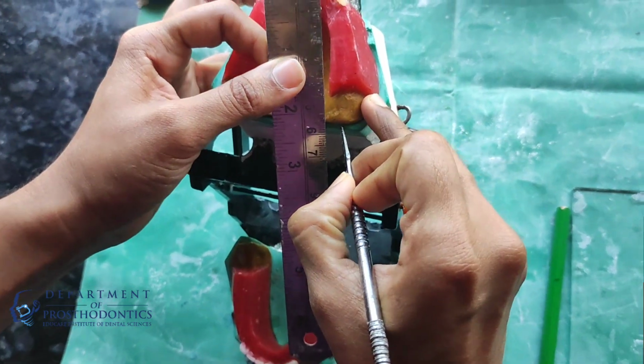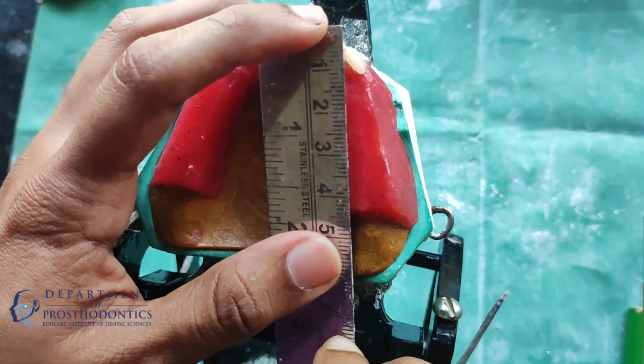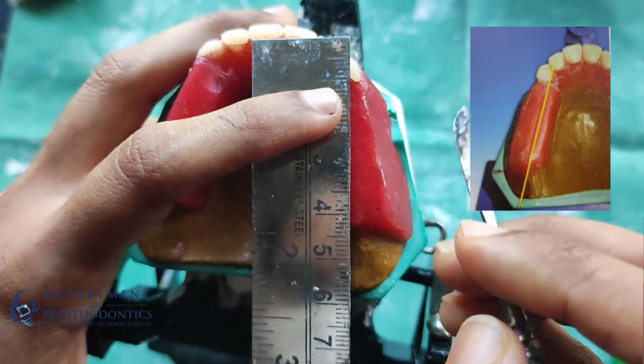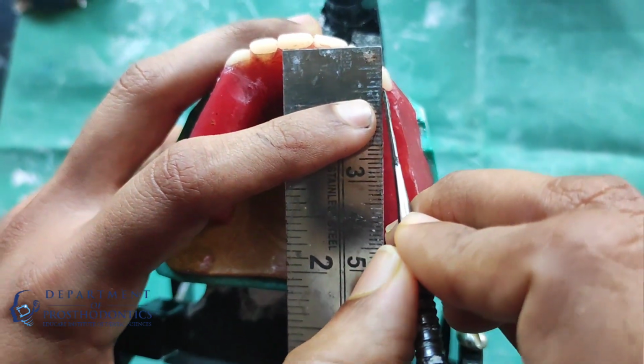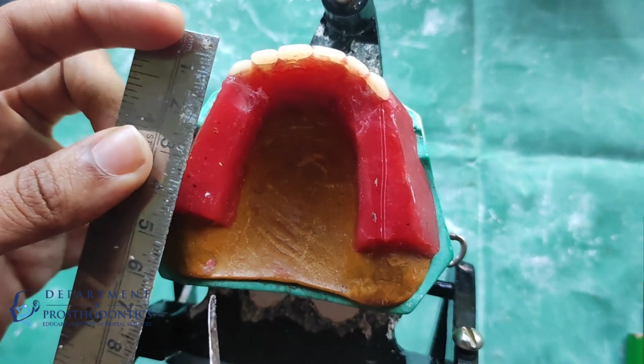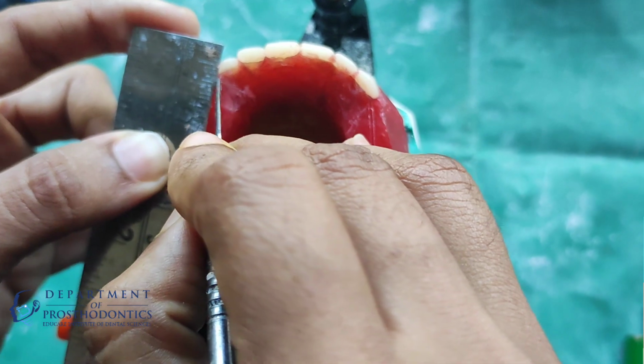Mark a line on the occlusal surface of the upper occlusal rim, a line connecting the midpoint of the lateral incisor and the line on the land area posterior to the tuberosity, which is exactly opposite to the line on the land area posterior to the retromolar pad. This line represents the palatal cusp of the upper posterior teeth.